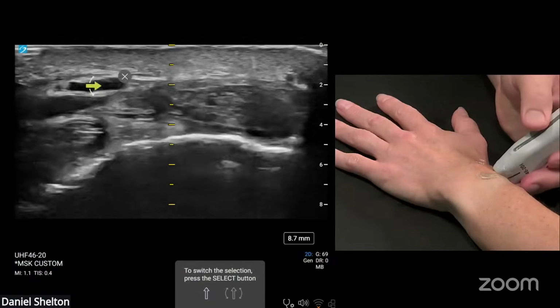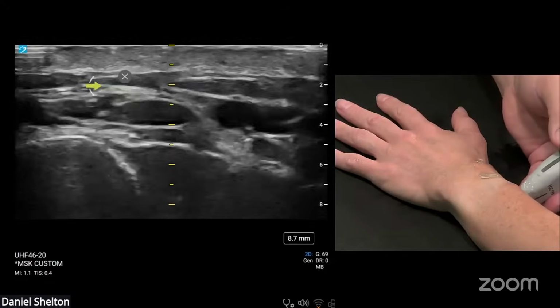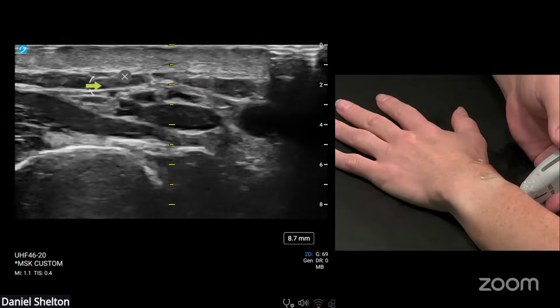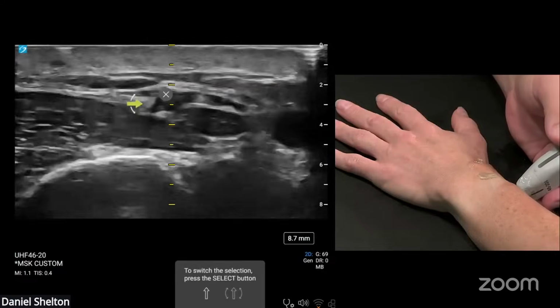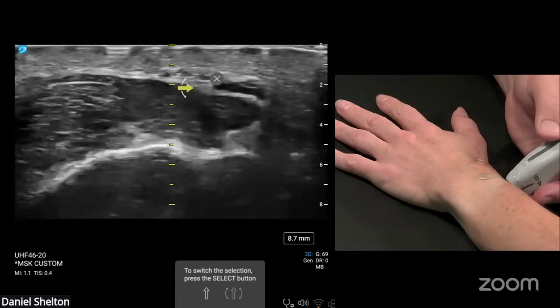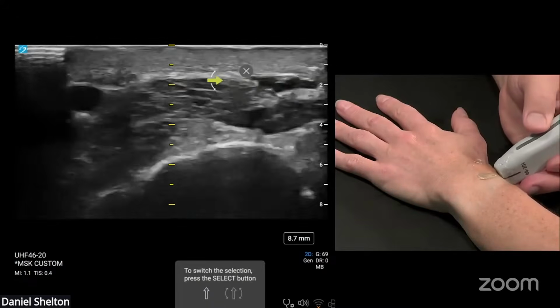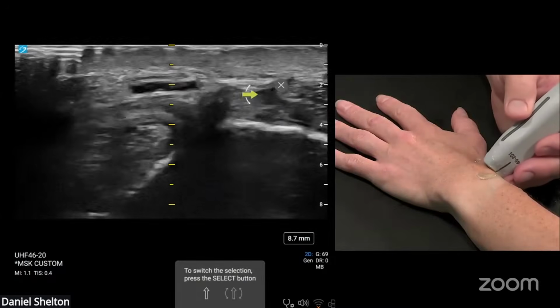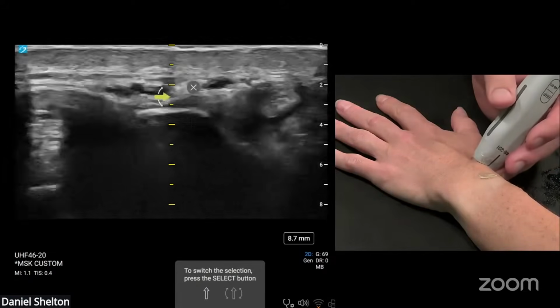So the nerve anatomy as you go distal from here is extremely variable. But right back here proximal to compartment 1, it's usually pretty uniform. So you just pick a branch and you go proximal distal, and then you go down a little further. Then you pick a branch, just the same scanning technique, back, forth, back, forth. Pick a branch. There, they just popped over that compartment 1, and now they're headed over on top of compartment 2. These are useful structures to map out.